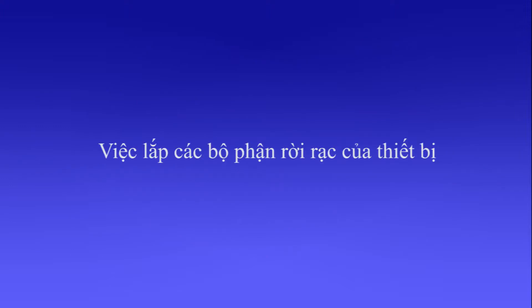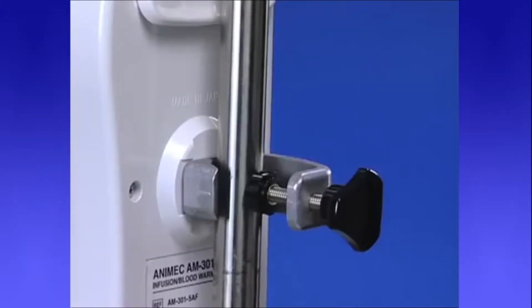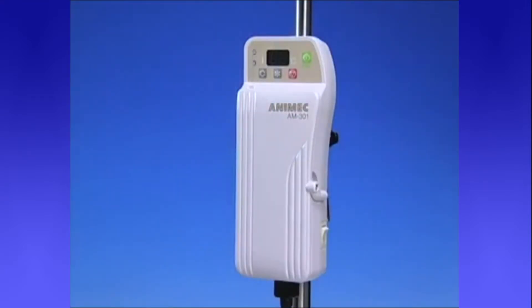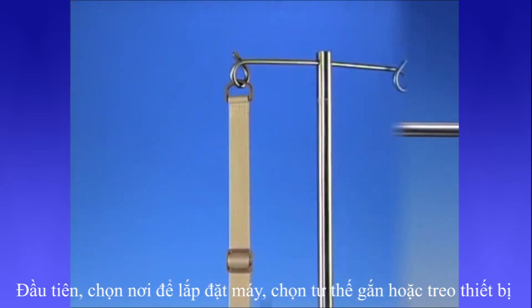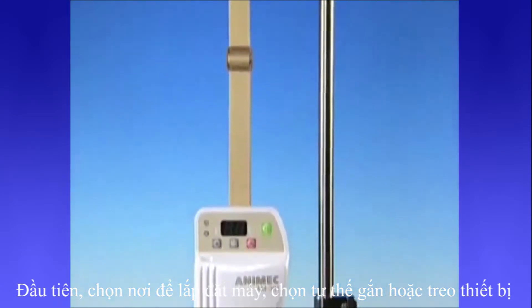Attachment of detachable, removable parts. Please choose a way of placement — either mount or hang from an IV pole.